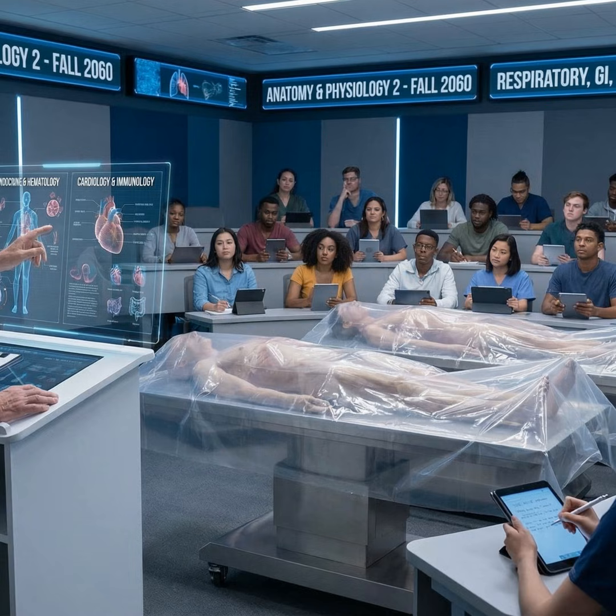Perfect. Let's do one more. This is another really common exam scenario. Different patient, different numbers, but we are going to apply the exact same process. Don't let the new details throw you off one bit. All right, let's run the algorithm again. Step 1, the ratio is 85%. That's high, so we're thinking restrictive. Step 2, the loop shape is that tall and narrow witch's hat, confirms restrictive. Step 3, the DLCO is low.